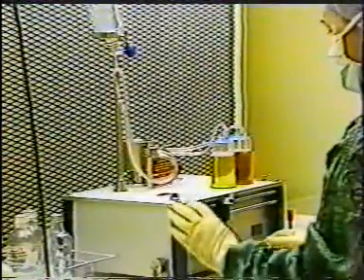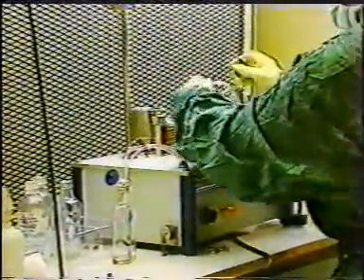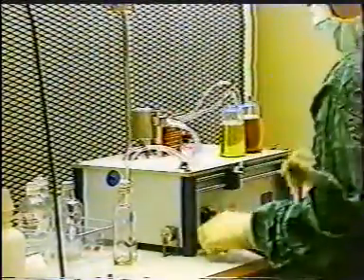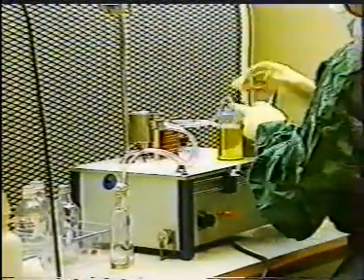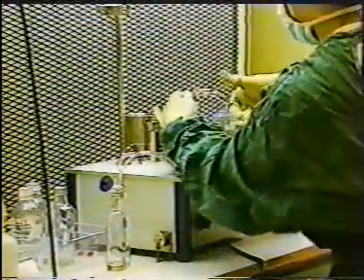It is important to realize the limitations of sterility testing. A satisfactory sterility test does not prove that a batch is sterile, or even that the samples taken from it are sterile. What it shows is that the samples did not give rise to microbial growth under the conditions of the test.